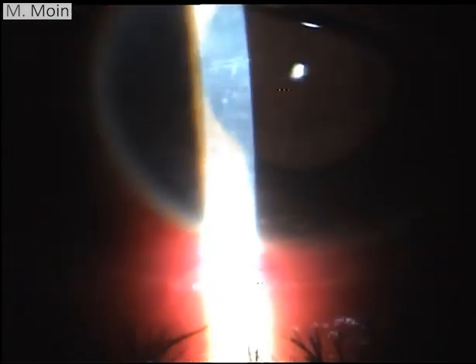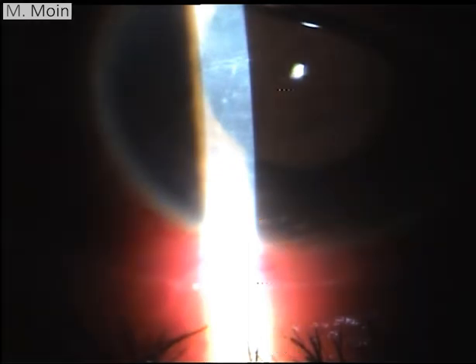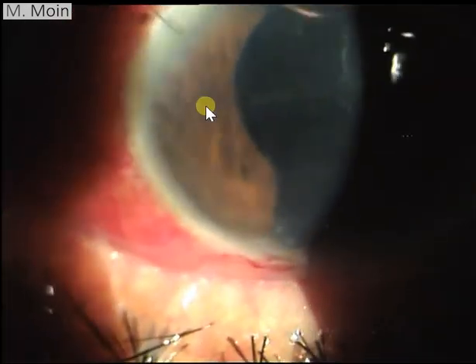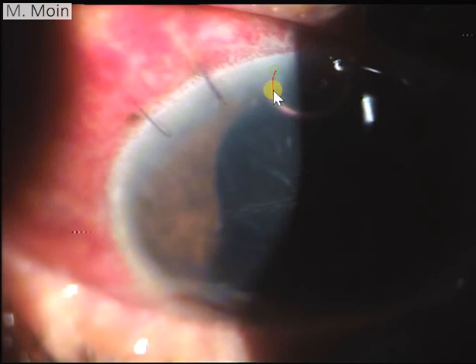Another interesting thing you see in this patient is these peripheral posterior keratic precipitates in the peripheral cornea. If we go forward, we'll see more of these. Here you can see those, and this is the superior limbus through which we went and removed the IOL, two sutures over here. And there's an air bubble over here which you need to demonstrate to the examiners. If you see an air bubble like this, you will say there's an air bubble in the superior part of the anterior chamber, probably 5% of the volume of the anterior chamber.